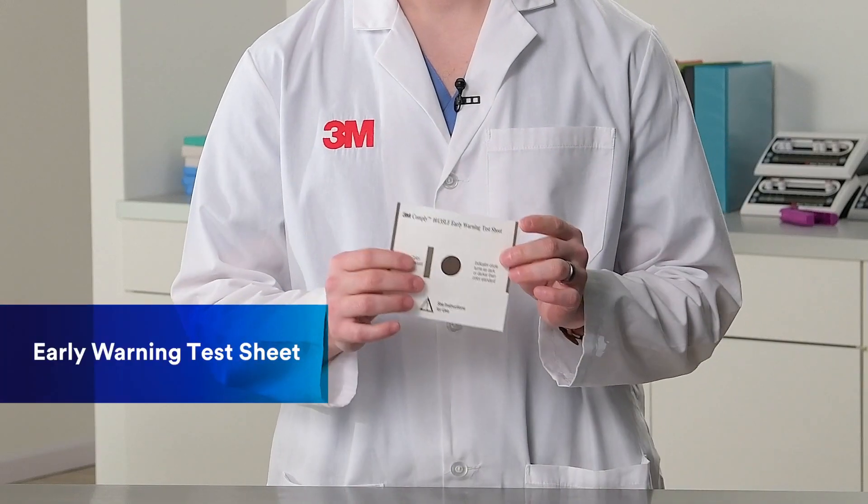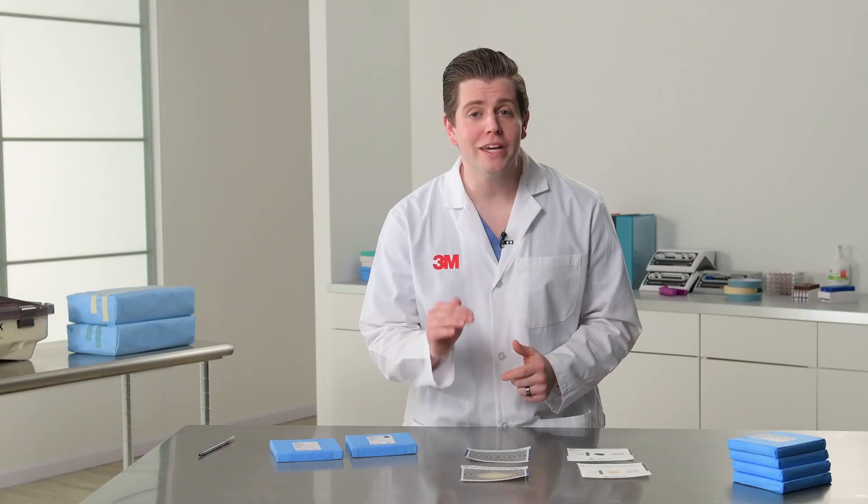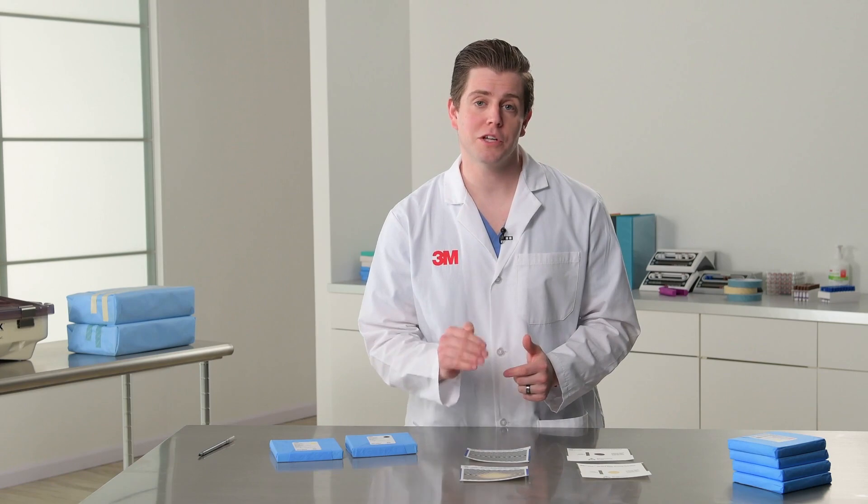Bowie-Dick Test Packs from 3M have an extra sheet — an early warning sheet. It's designed to be more sensitive and placed lower in the test pack to detect air problems in the sterilizer earlier. Early detection means you can schedule maintenance at the first signs of trouble and prevent shutting down your sterilizer for the rest of the day.